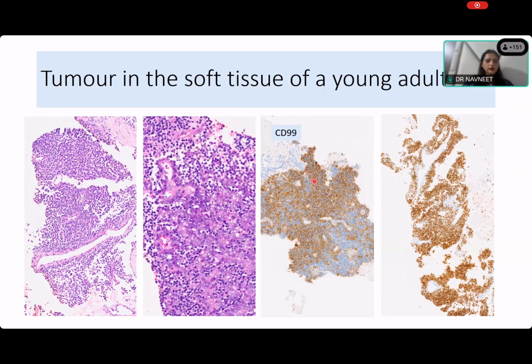Yes, ma'am. Very good. We've done CD99, which is also called MIC2. Now, what do you think this immunohistochemistry is? These are all nuclei that have taken up the stain. This is CD99, which you can see is membrane, because you can see the nuclei have not taken up the stain, and you can see the membrane stain with the unstained nuclei. Here, the nuclei have the stain. So what is this antibody that has been used? No idea? All right. Lalit, what is the antibody that has been used?